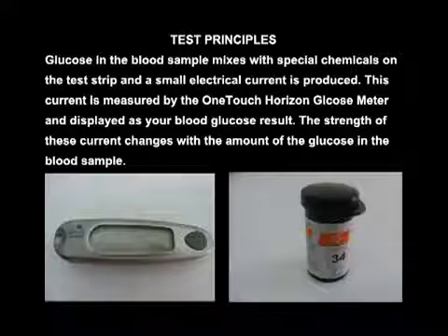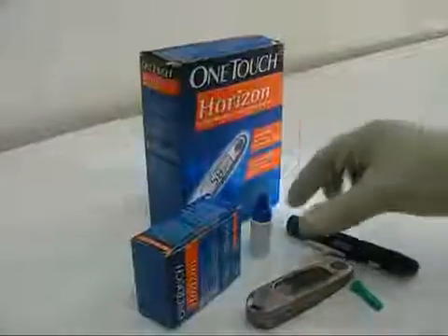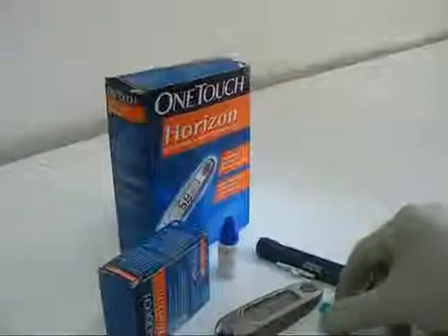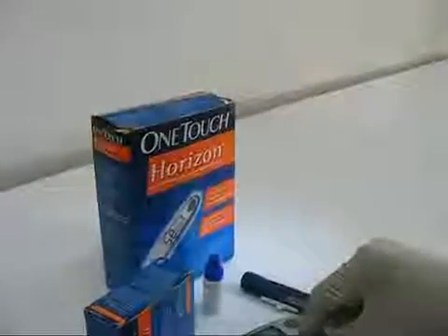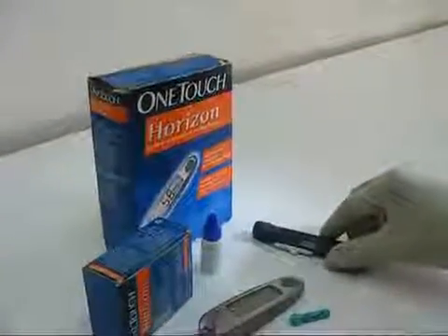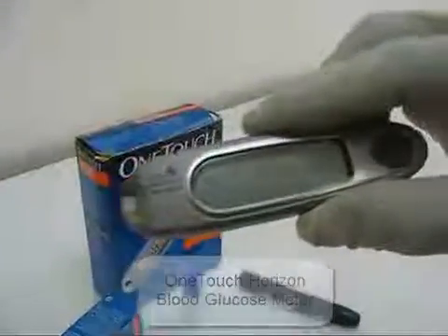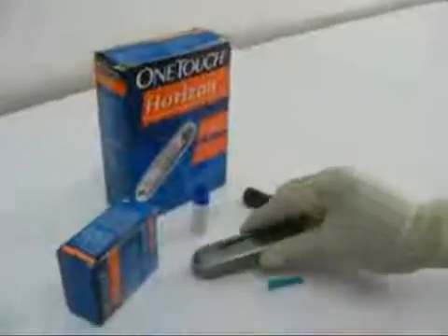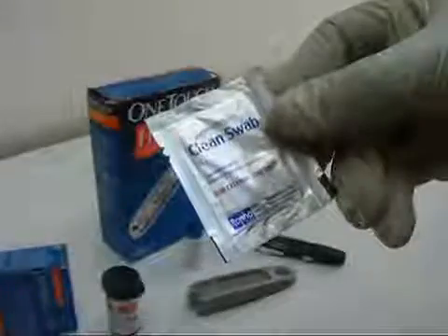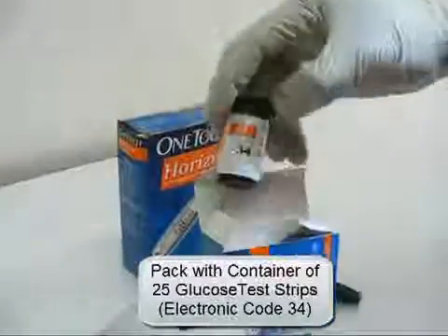The strength of this current changes with the amount of glucose in the blood sample. The One Touch glucose monitoring kit consists of a One Touch Ultra control solution, a lancet, a lancet holder, a One Touch Horizon blood glucose meter, a clean alcohol swab, and a container with 25 glucose test strips of electronic code 34.